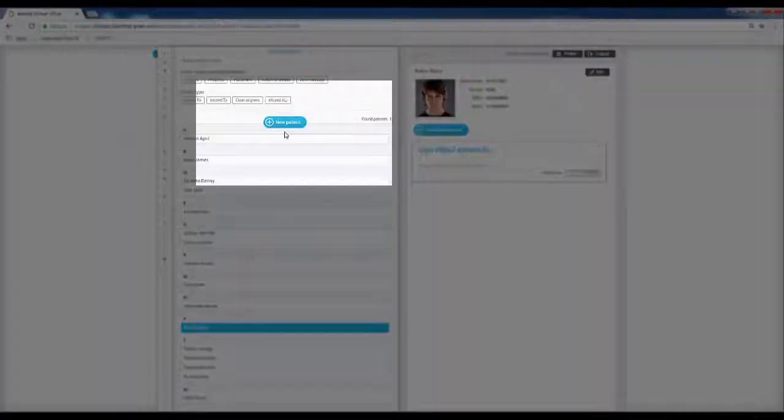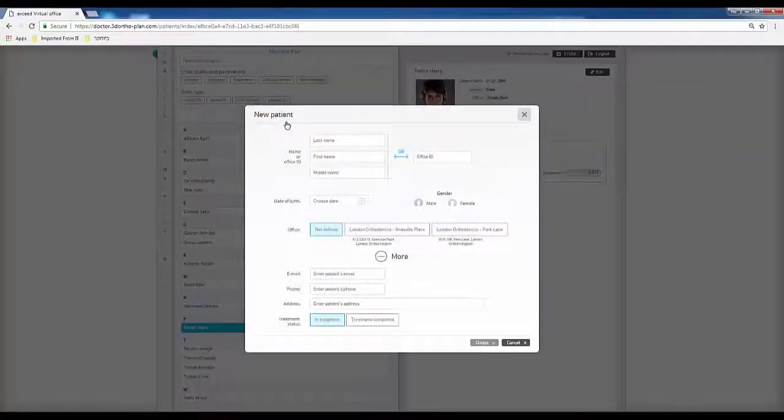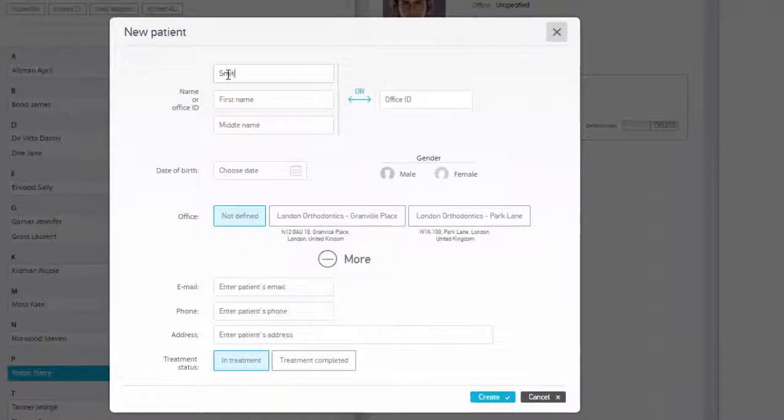To place a new order, hit the New Patient icon and fill in the necessary details. When done, click Create.